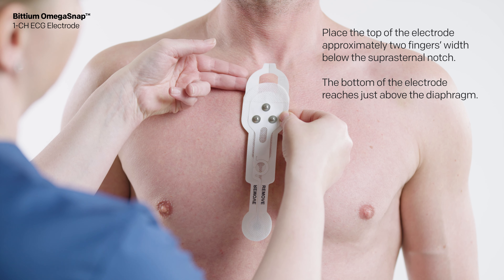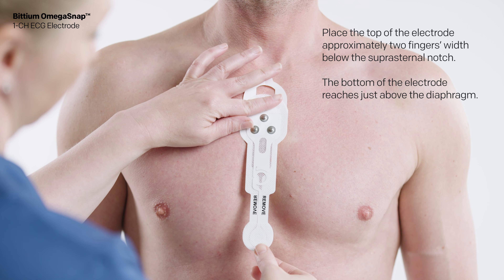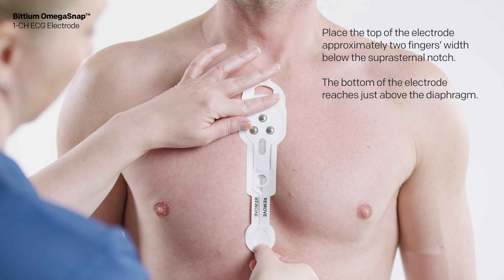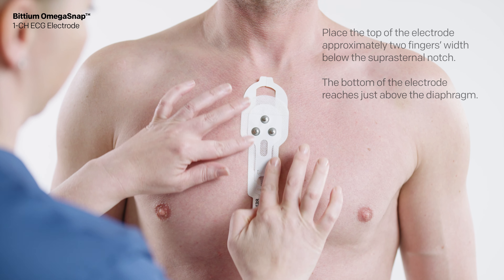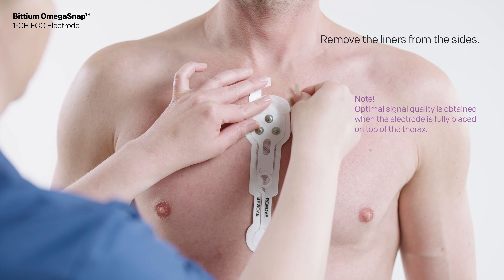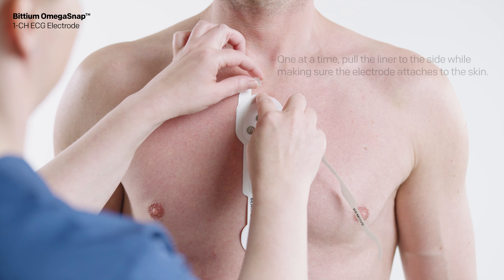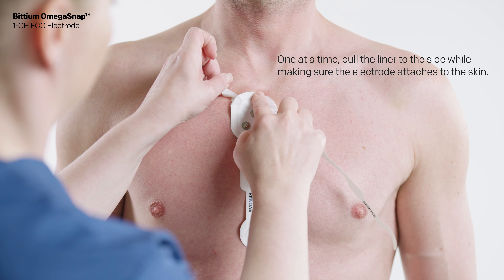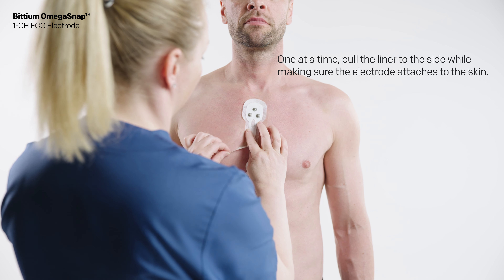Fix the electrode onto the skin. Place the top of the electrode approximately two fingers width below the suprasternal notch. The bottom of the electrode reaches just above the diaphragm. When the electrode is properly attached, remove the liners from the sides one at a time, pulling the liner to the side while making sure the electrode attaches to the skin.